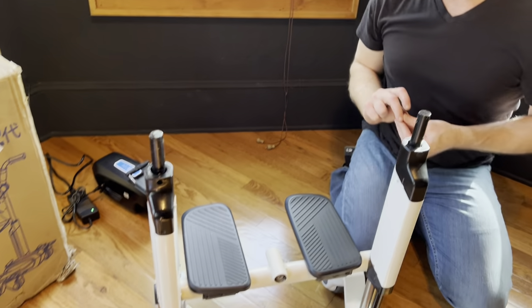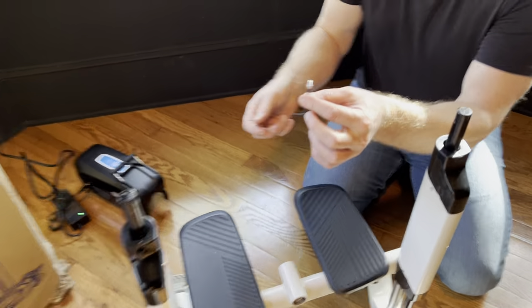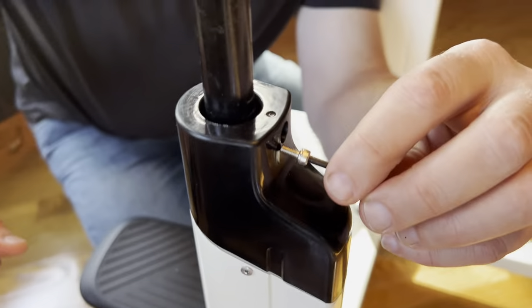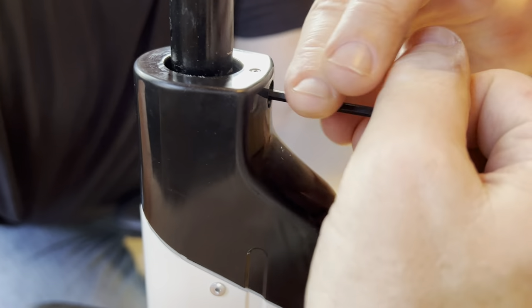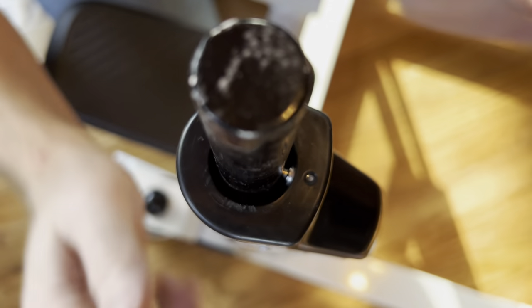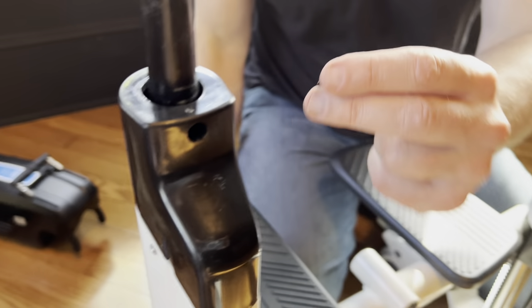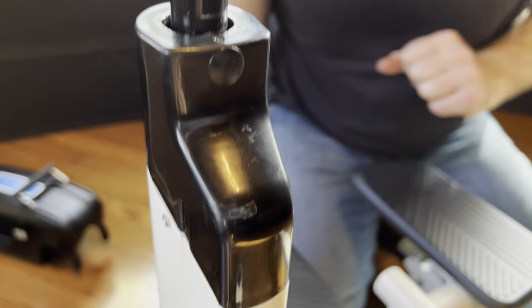That makes it very simple. So we'll do the same thing on the other side. I just get this screw here and I'm going to very simply line it up. I mean, I can practically do this with one hand. Screw it in to the point where it's going to keep this in place, and then I put the cover on.